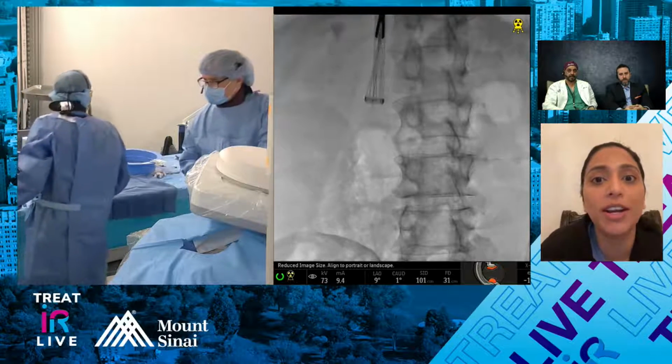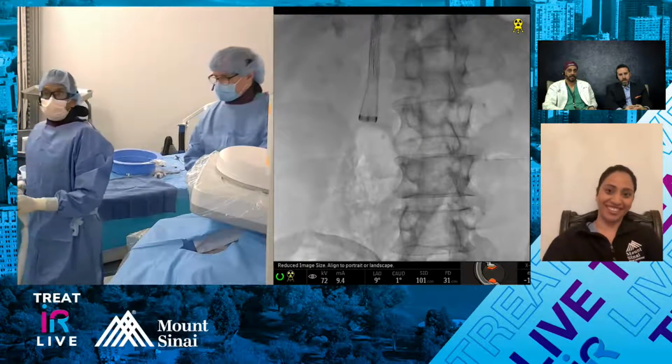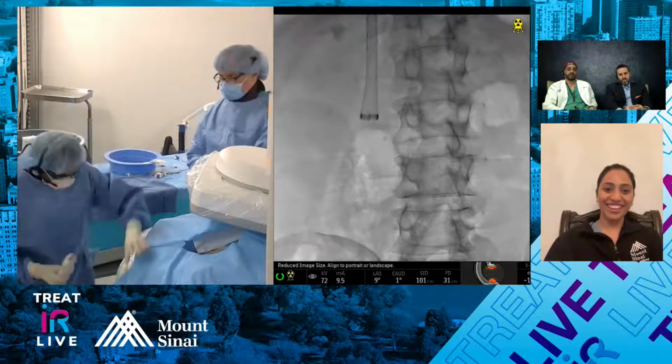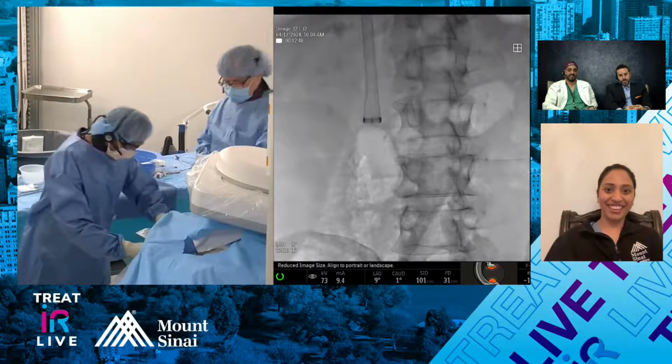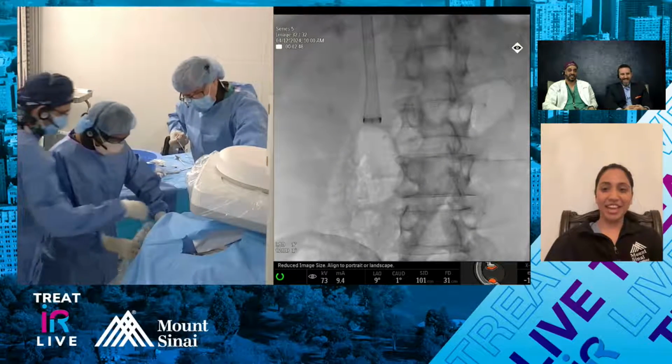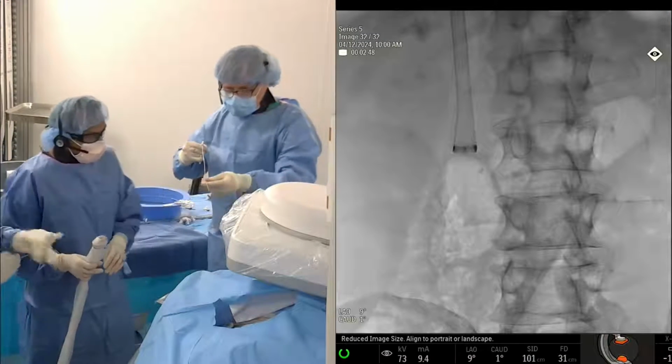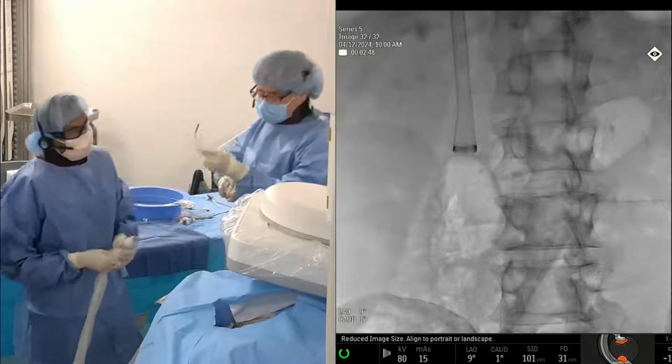Scott's trying to straighten it out right now. Oh, it's straight. There we go. Yep. Yeah, we got it. I got it. Okay. Oh, nice. So I let go of the thread, and then grabbed it closer to the hook and the arch blows. Excellent. Nice job, Scott. Strong work. There you go.